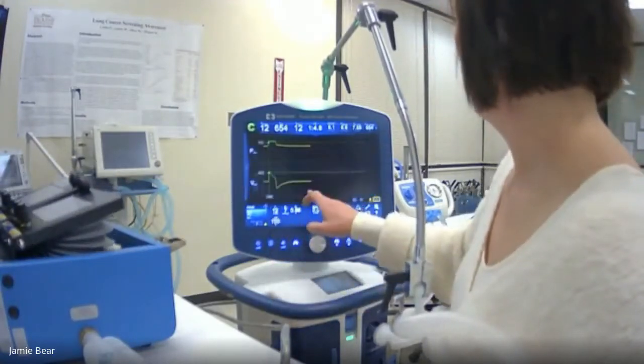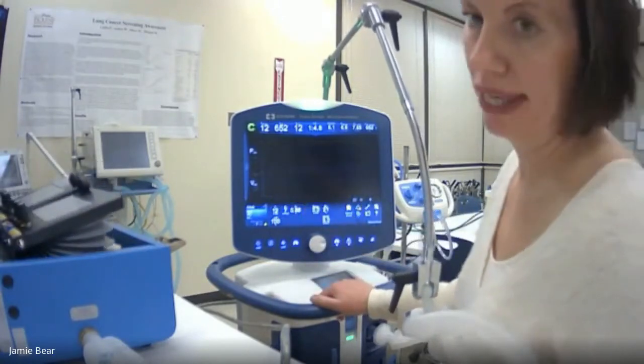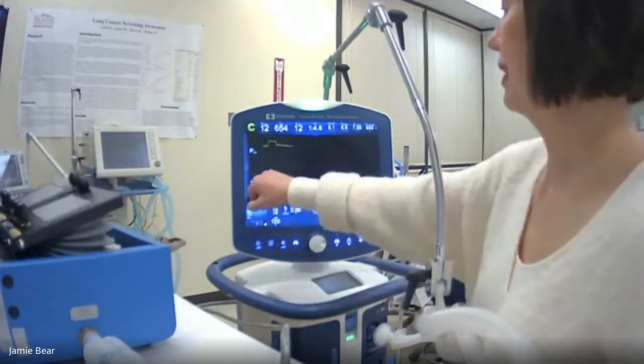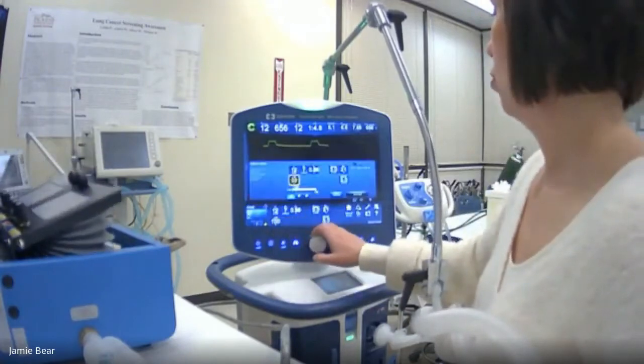So here, we'll take that away. So we'll continue on. That just paused it. Now we'll go back to real time again. So we'll let this catch up. And as I said, you can see a little bit of peak here. So we will go down some.